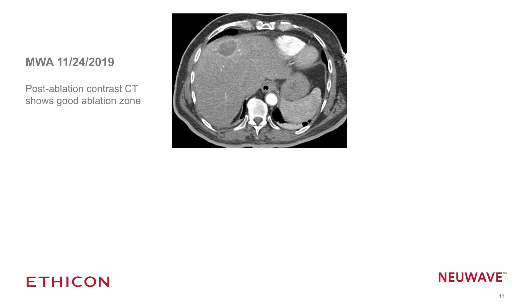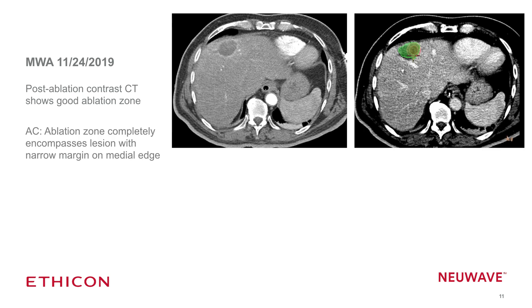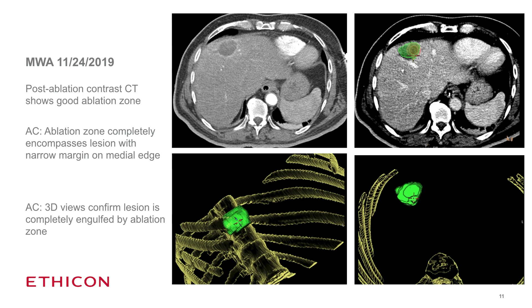At completion of the procedure, while the patient was still under anesthesia, we performed a contrast CT showing a good ablation zone. We used the ablation confirmation software to compare our ablation zone with the known location of the lesion. We confirmed that we did encompass the lesion, although the medial margin was relatively small — we could have advanced the needles a bit farther for a better medial margin. Still, we were quite happy with this result, especially given the shrinkage that can occur with microwave ablation.